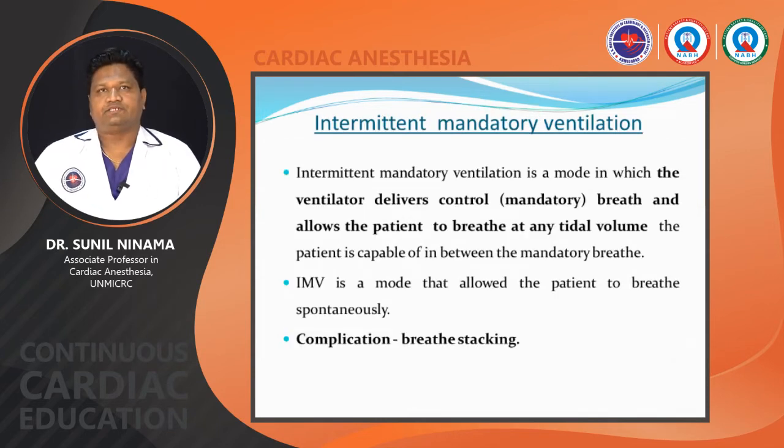Intermittent mandatory ventilation. Intermittent mandatory ventilation is a mode in which the ventilator delivers the mandatory control breath and allows the patient to breathe at any tidal volumes in between the mandatory breaths. It is a mode that allows the patient to breathe spontaneously. What do you mean by that?